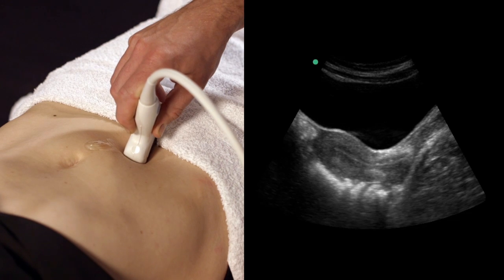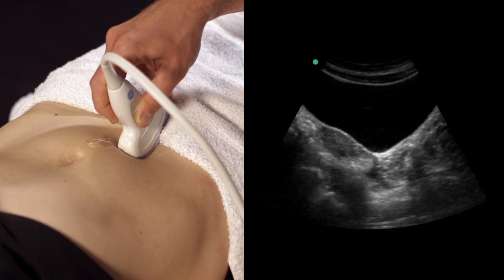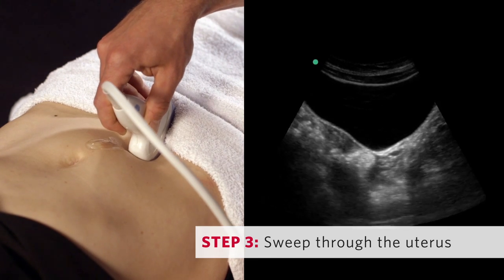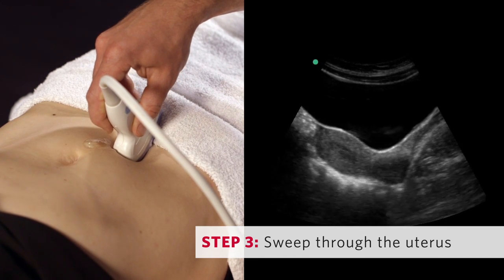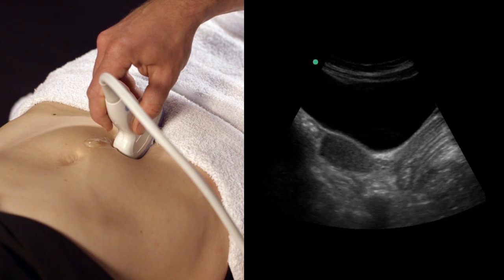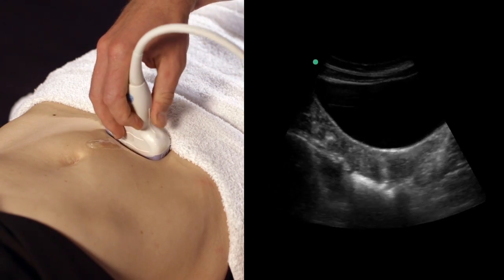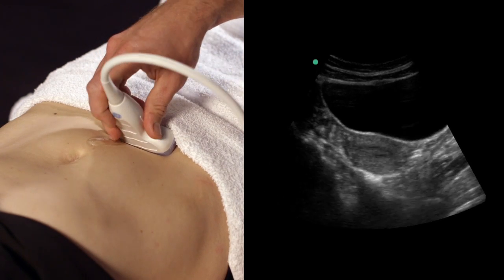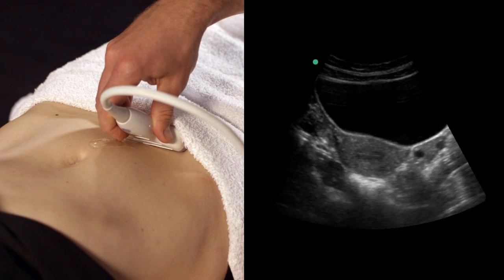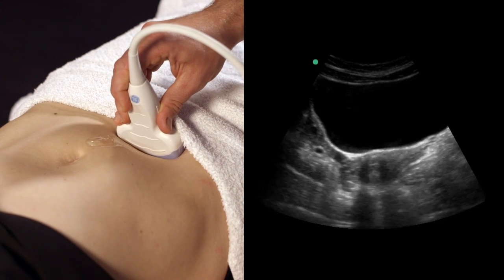Once you've identified the uterus, you can proceed to the next and final step: identifying an intrauterine pregnancy. Sweep through the entire uterus to identify an intrauterine gestation. Once you've performed a thorough sweep in longitudinal, you should do it again in transverse. To diagnose a pregnancy, you need to see both a gestational sac and a yolk sac, which is the earliest definitive sign of pregnancy. In a more advanced pregnancy, you may see the fetal pole in place of the yolk sac.